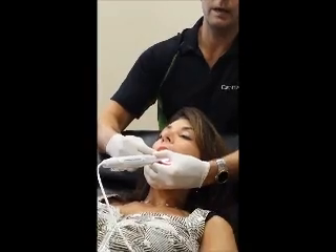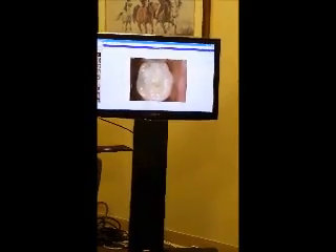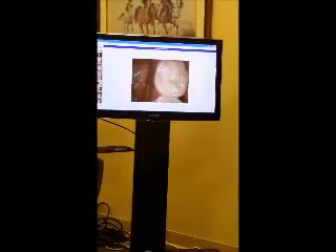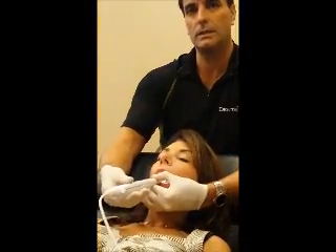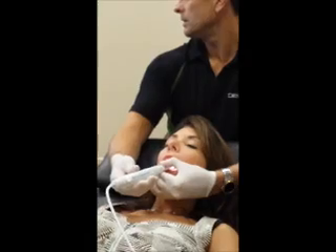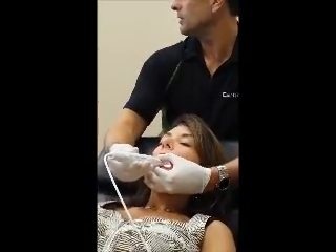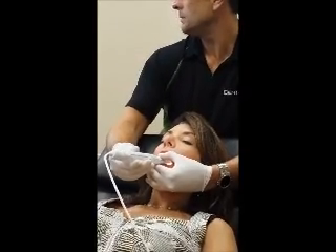You can see the image — nice and clear — I'm at the correct distance and it makes it easy to adjust. If I'm a little out of focus, I can get closer by just fulcruming. This is how I'm controlling my distance: fulcruming on the same arch. If I've got it set there and I run it along the same arch, you'll notice that keeps me at the correct distance where I'm in focus, and I really don't have to change anything.